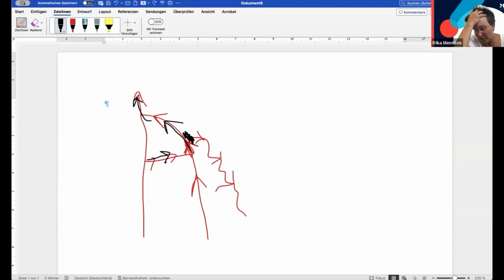Yeah. This is why I wouldn't select foam sclerotherapy in the first place, but if you think of it, always when you make foam sclerotherapy of the great saphenous vein, you will have inflow of foam into the deep vein, and nobody bothers what will happen with the deep vein, because as soon as the foam gets in touch with blood, it will not be effective. So I would expect the same here, but personally, I would prefer a little surgical incision here and a flush disconnection of the tributary at the level of the great saphenous vein. And then I would wait to see what happens.